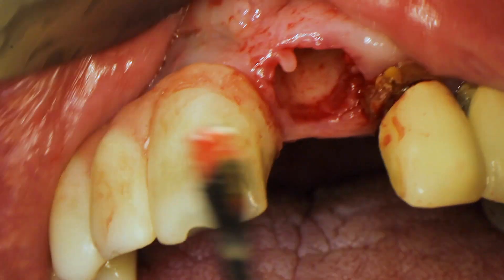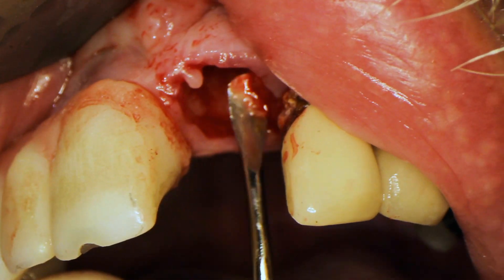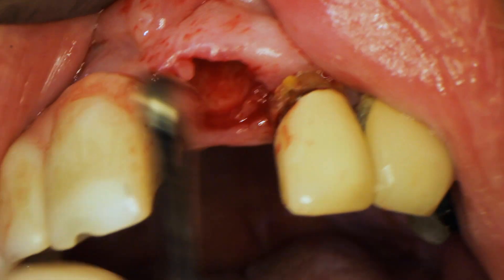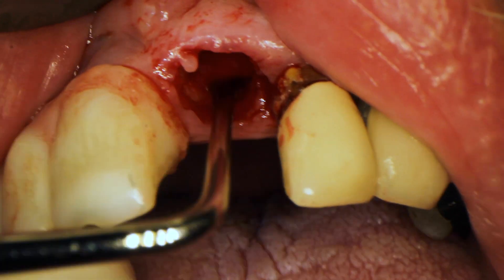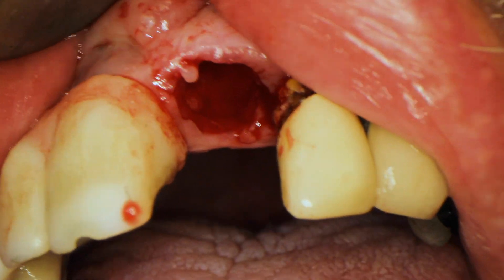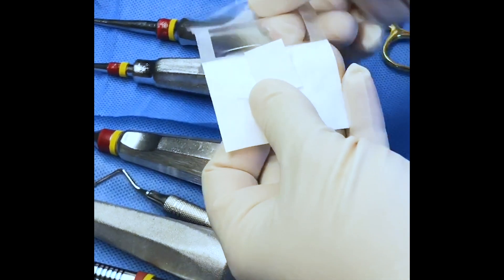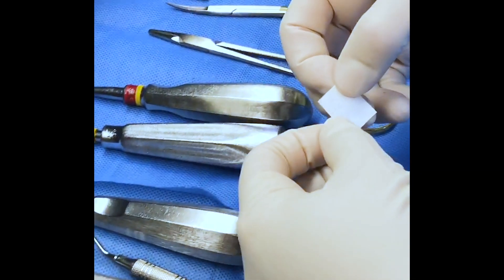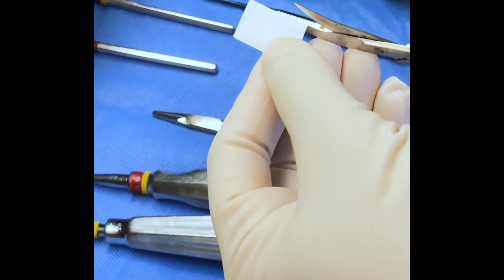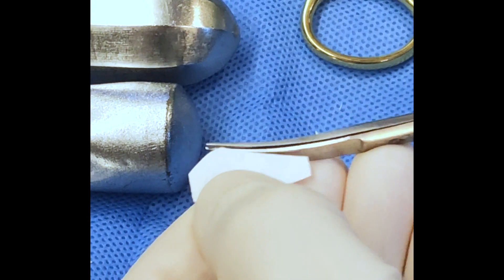If there is a dehiscence, that's a perfect candidate for the ice cream cone technique. It won't work well if the entire wall is missing — then you might need more extensive GBR techniques. But if there's just a small dehiscence where a periapical infection went through, you can use this technique. Now that the socket is cleaned out, I take my little rectangular membrane and cut it into the shape of an ice cream cone.